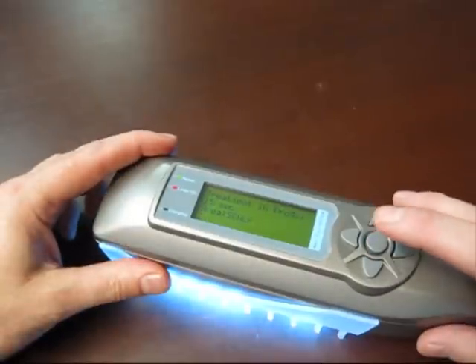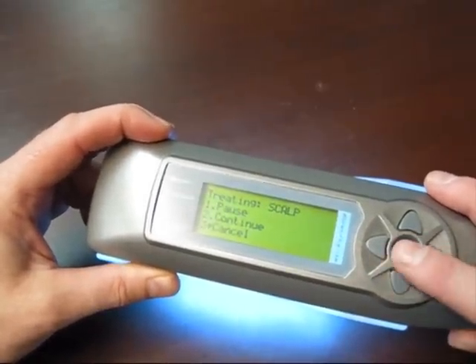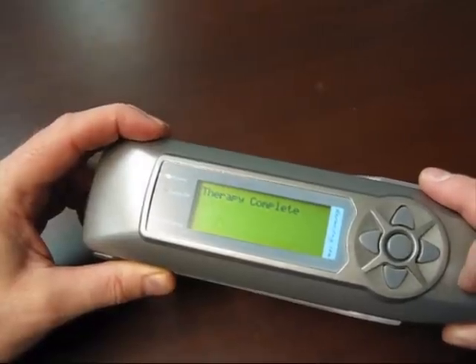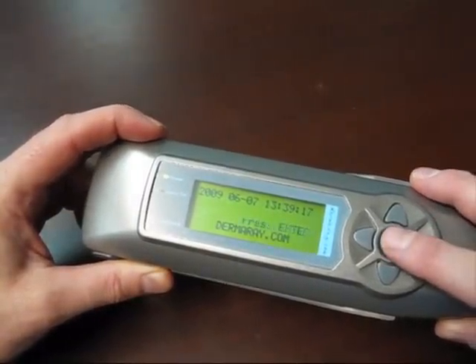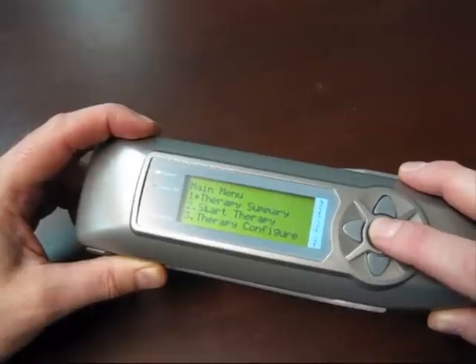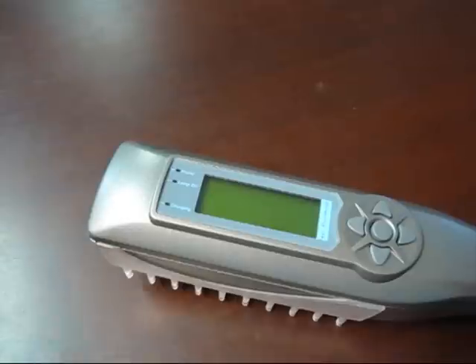To stop a treatment at any time, you can press enter: pause, continue or cancel. To turn off Dermaray, hold down the enter key for 3 seconds. And that concludes this demonstration.